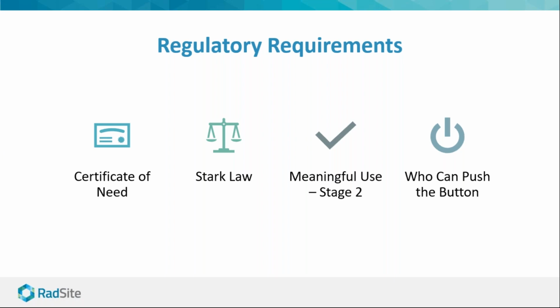Actually, it doesn't necessarily vary state to state. It varies from specific room to room. So depending on the room that you want to utilize your CT scanner in, and depending on the utilization of adjacent rooms, we calculate the distance to ISO center of the CT scanner and can calculate exactly what shielding is needed before we install the scanner. So we provide a shielding plan, and in most cases, additional shielding is not required. In all cases, an operator barrier is required, and that's included with all of our installations.